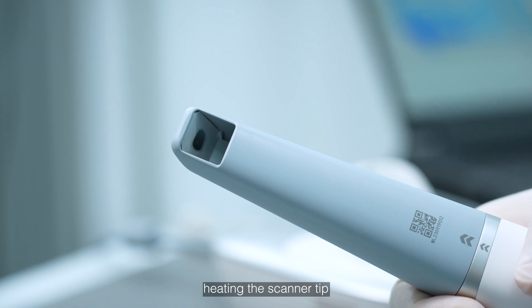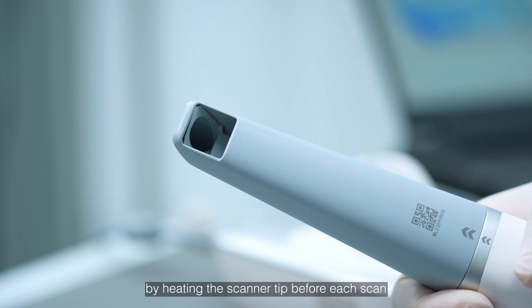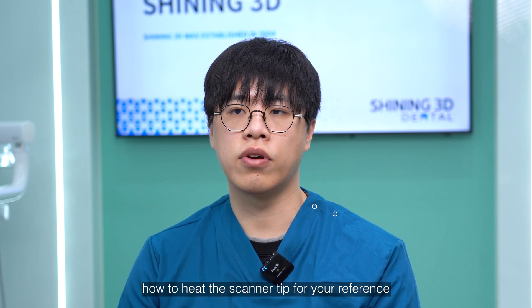Fourth, heating the scanner tip. To achieve the best data quality, please ensure that there is no fog on the mirror by heating the scanner tip before each scan. We have a video demonstrating how to heat the scanner tip for your reference.